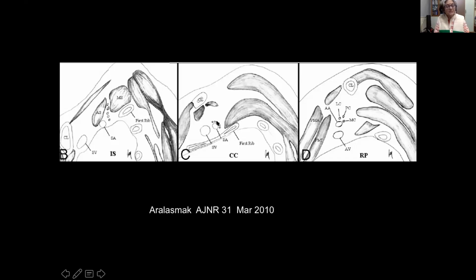And now we will see the divisions and the cords all around the subclavian. The cords will be around the axillary artery. Here you can see the divisions. And as you come more laterally, you have the retropectoralis minor space. So this is pectoralis major, this is pectoralis minor.